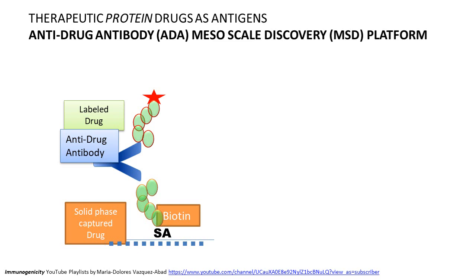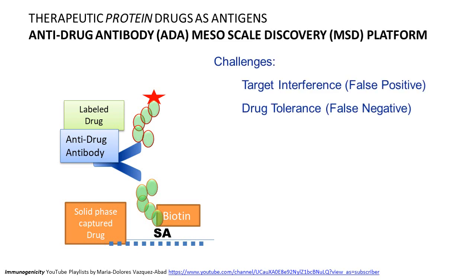What are the many challenges, and why are we talking about validating these assays? When you get false positives or false negatives, what's happening? It seems like a seemingly simple idea, but it's not that easy. The major challenges are what we call target interference, which can lead to false positive results, and drug tolerance, which can lead to false negative results.